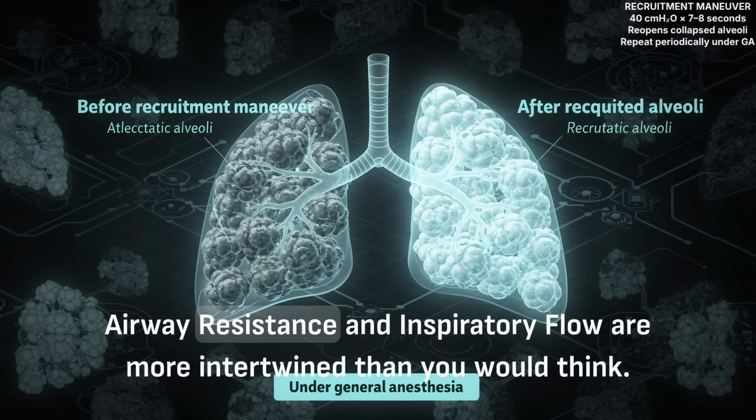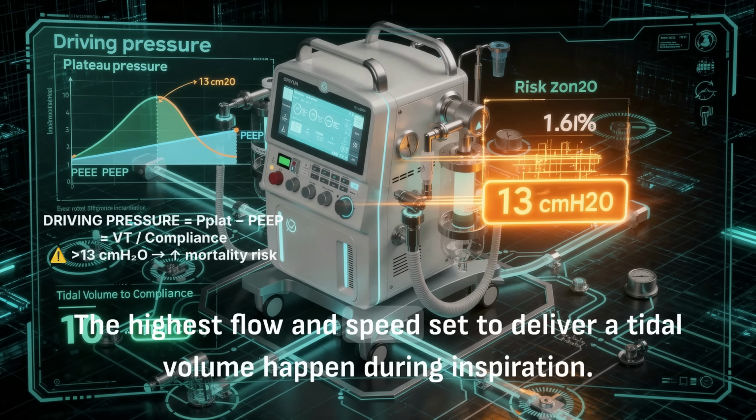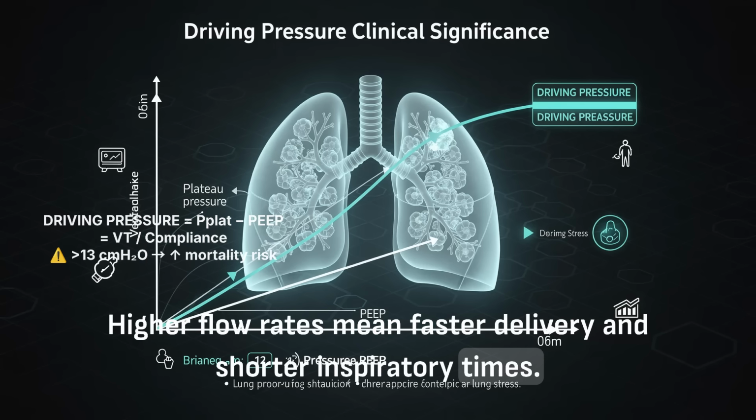Airway resistance and inspiratory flow are more intertwined than you would think. The highest flow and speed set to deliver a tidal volume happen during inspiration. Higher flow rates mean faster delivery and shorter inspiratory times.